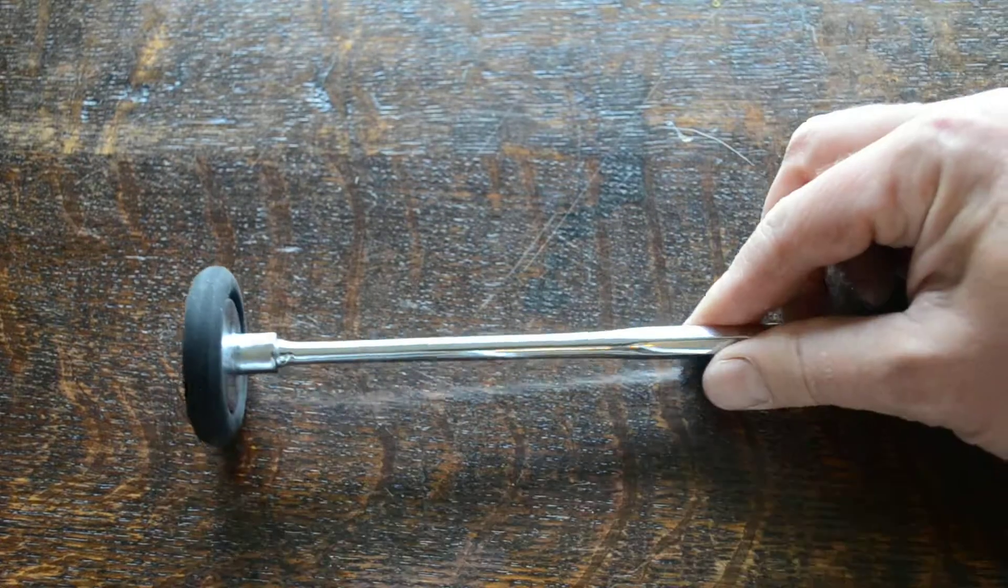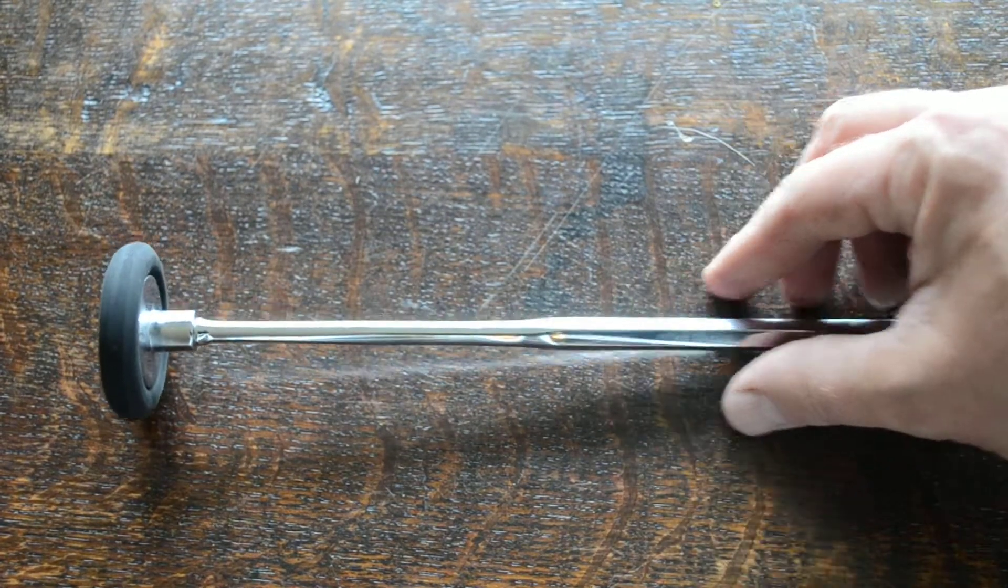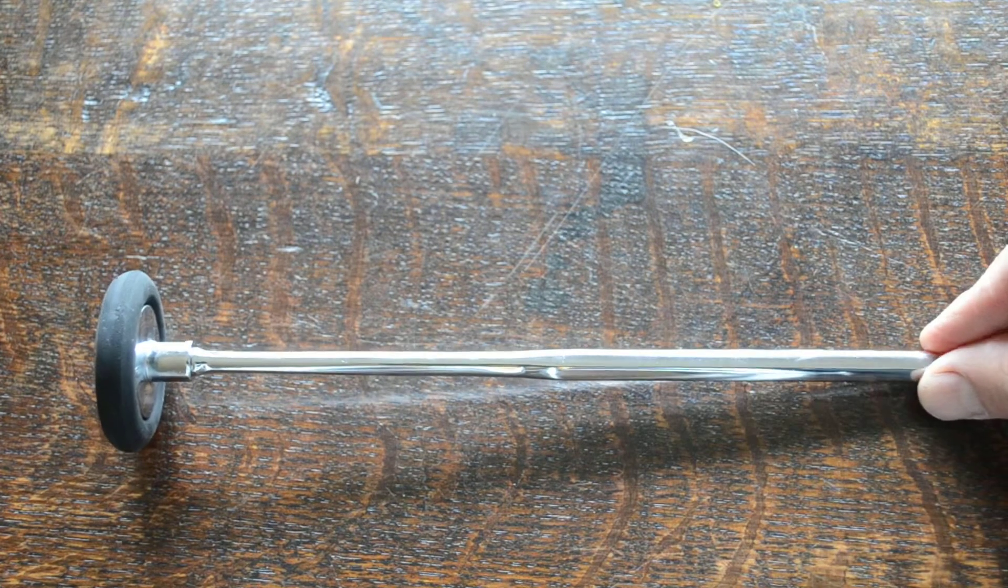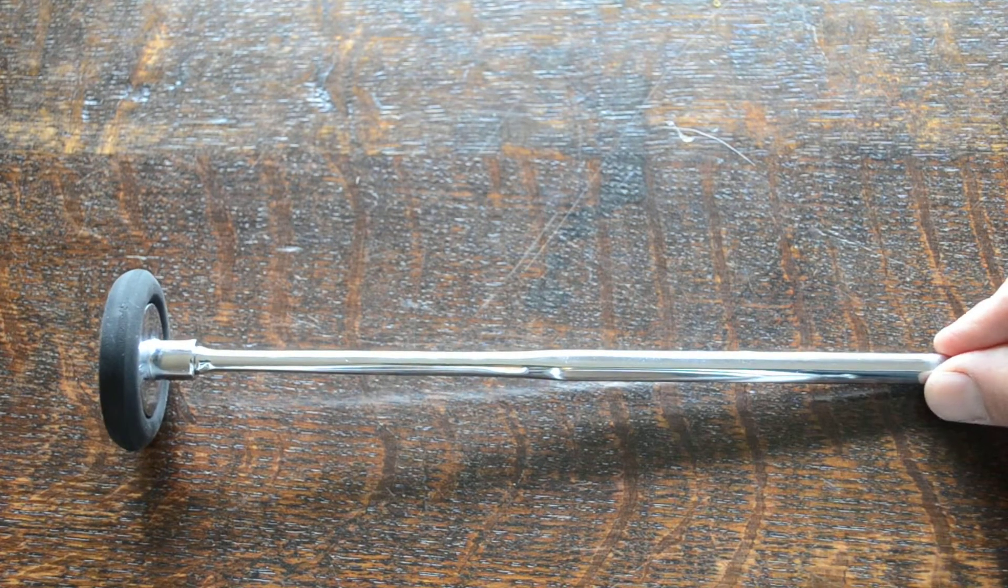Attach it in a standard Queen Square format and you've got your standard Queen Square reflex hammer.